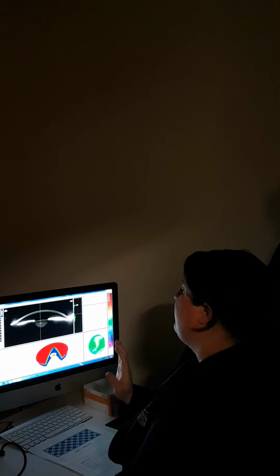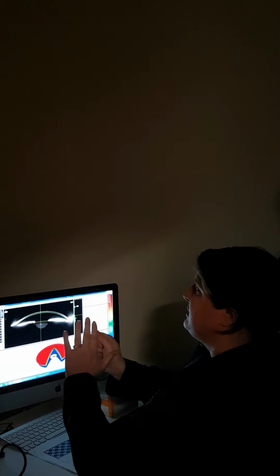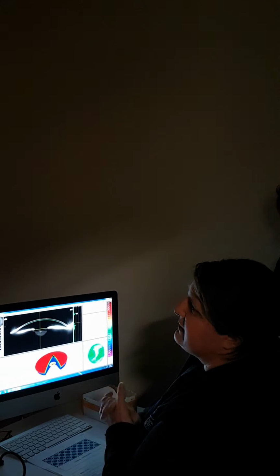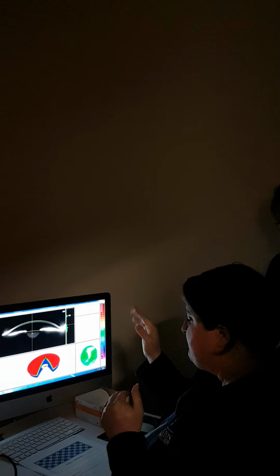And then again, I line up the cross section so that I'm almost on the line, get it centered, and then all I have to do is gently move forward and my image goes. So that's helpful. Also, sometimes you'll see on the targeting map, the yellow target comes and goes.